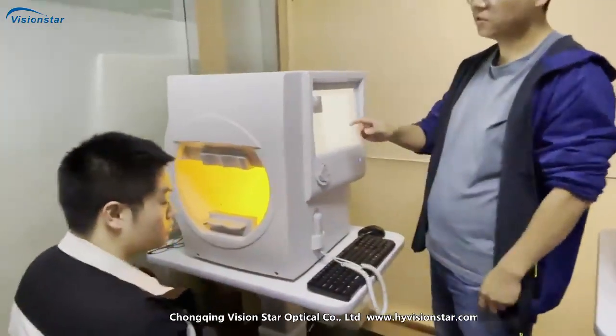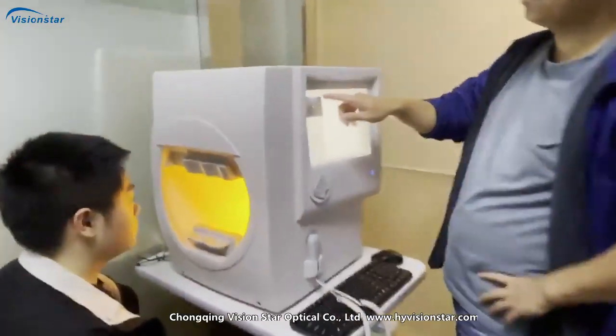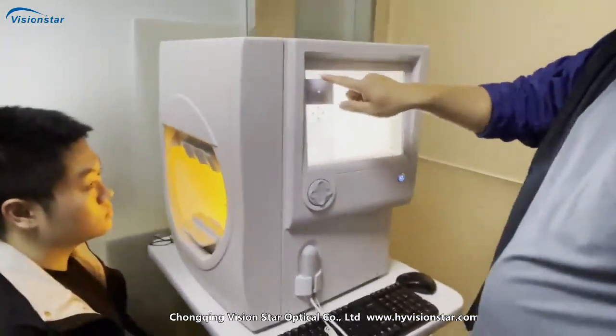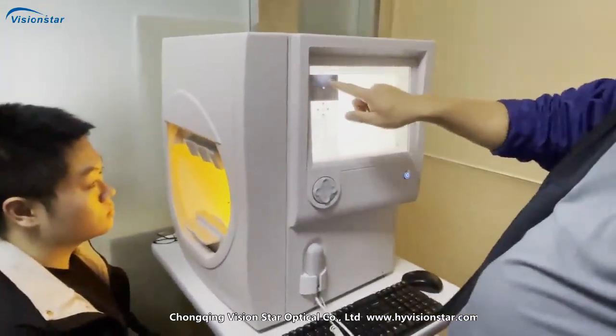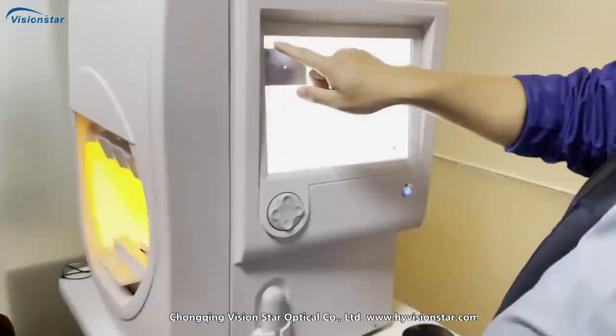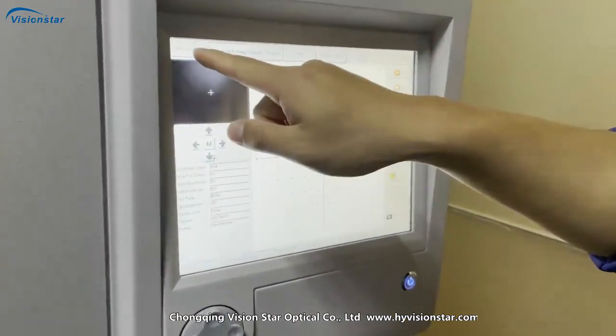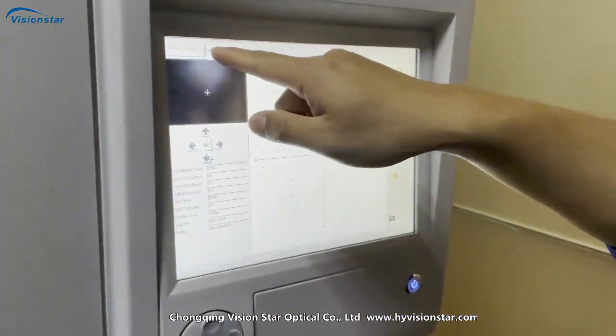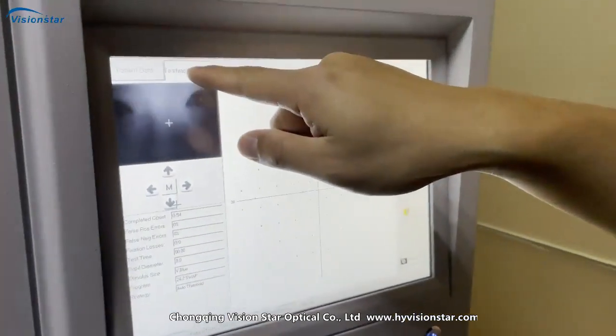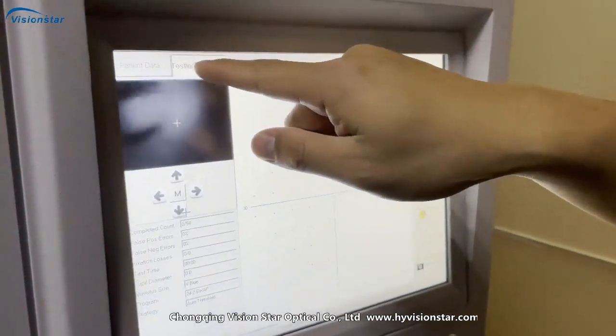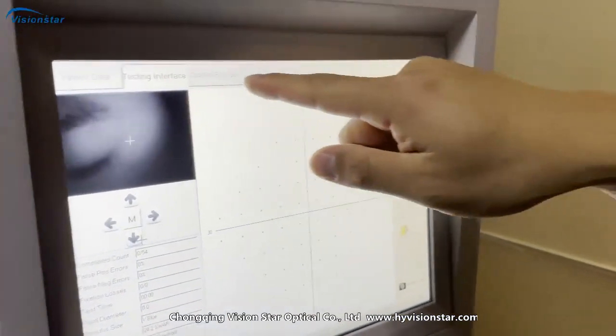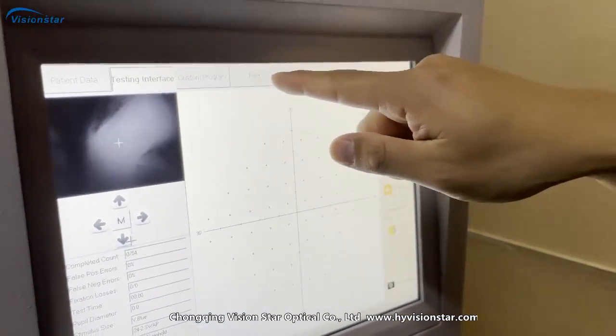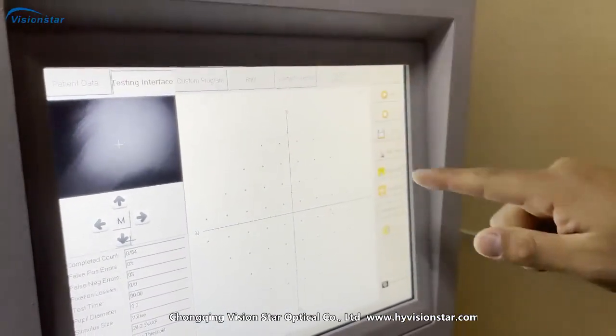Okay, let's show you the information. The software interface, this part is, you see there are five parts: patient data, testing interface, custom program, print, system setting.